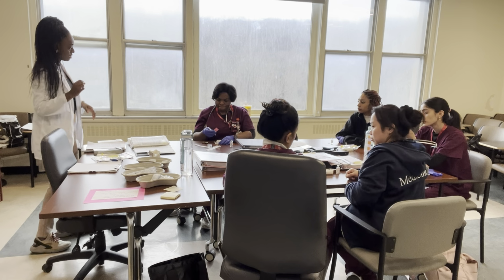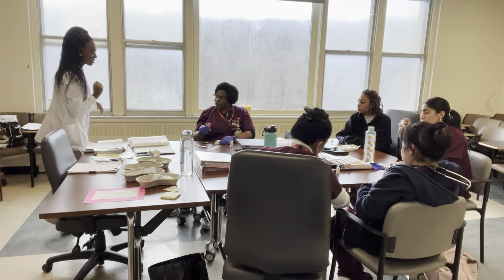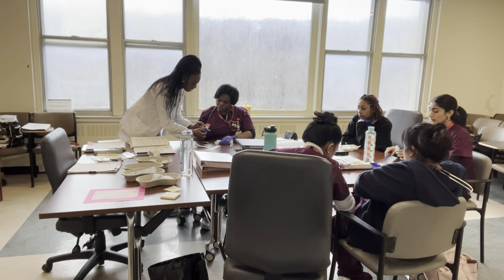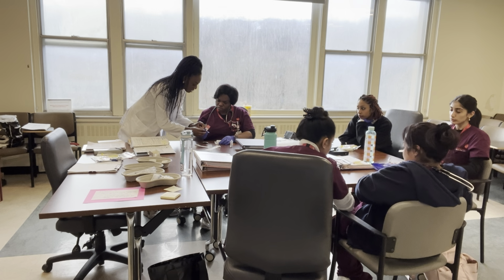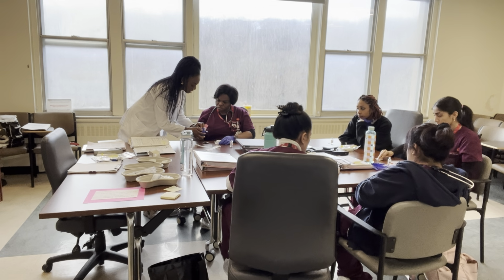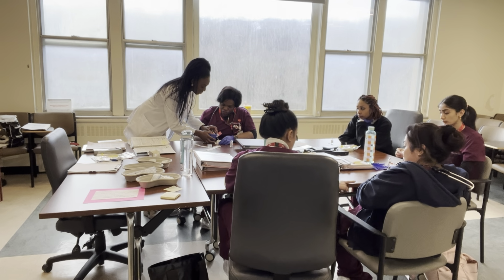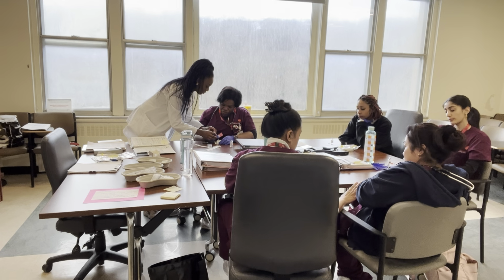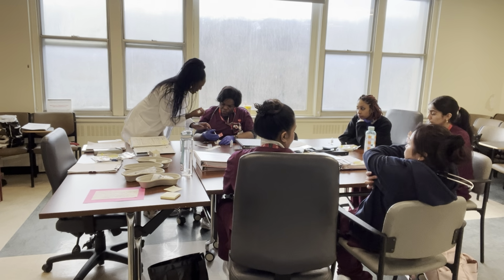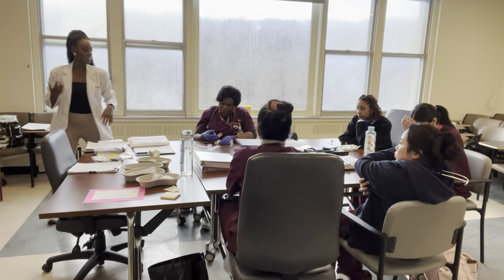So take it out. Okay, so you want to hold it like a dart. So your fingers are holding it, and I'll be holding it like a dart. Careful. So then when you go into the patient's skin, you go in, 2, 3, and then you're holding, and the thumb goes here. There we go, that's better. You see you didn't let go? Good job. And then you inject.